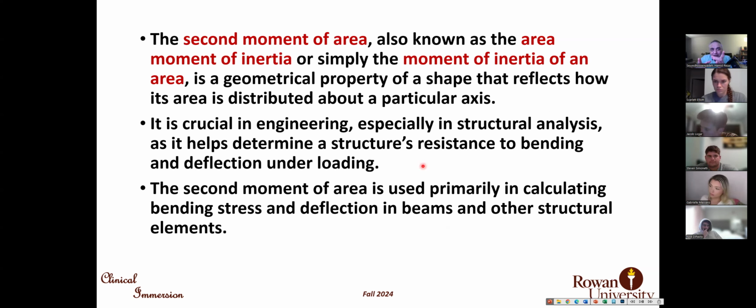Based on it, you know how the material is distributed around that central axis. If it is distributed further away, the second moment of area is higher.